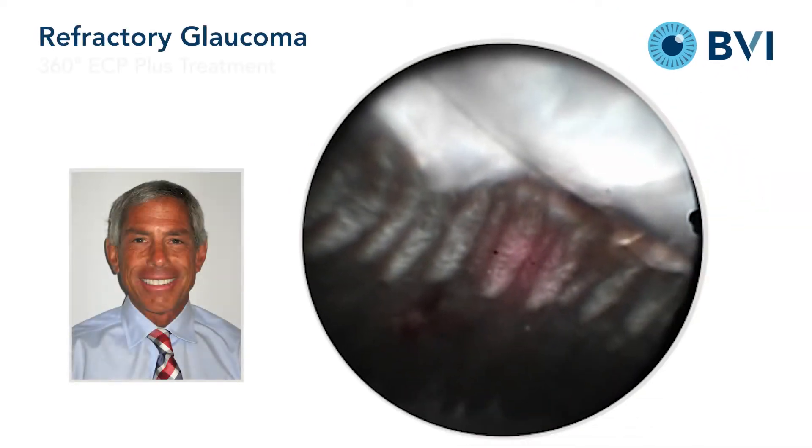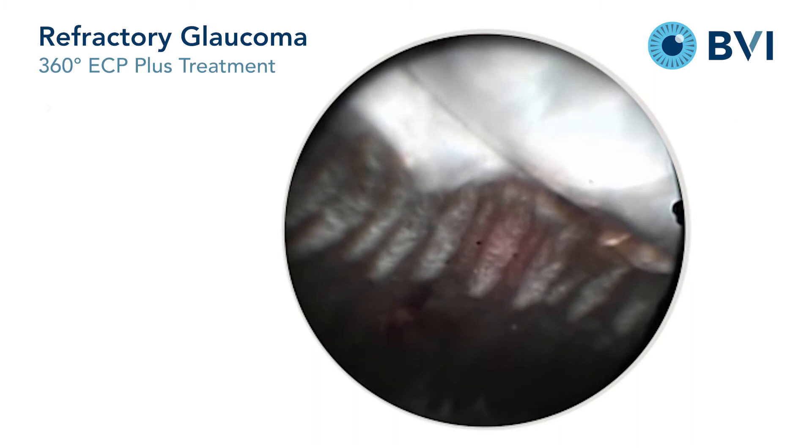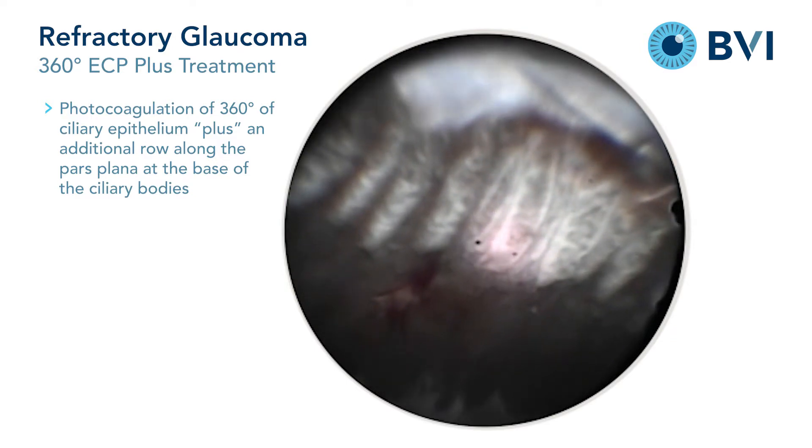In this video, one can see the performance of ECP for 360 degrees plus. This is quite useful in the management of refractory forms of glaucoma.